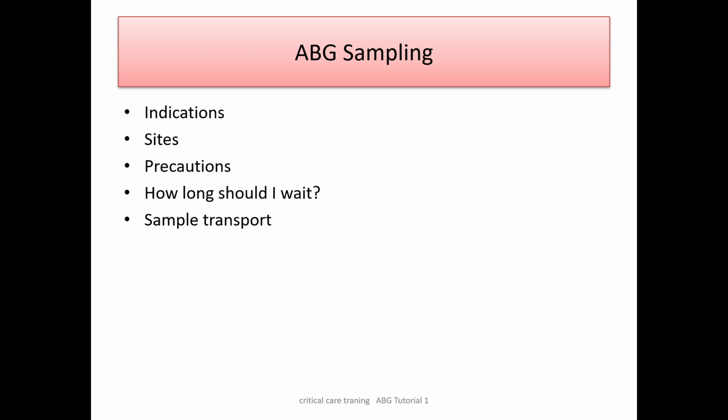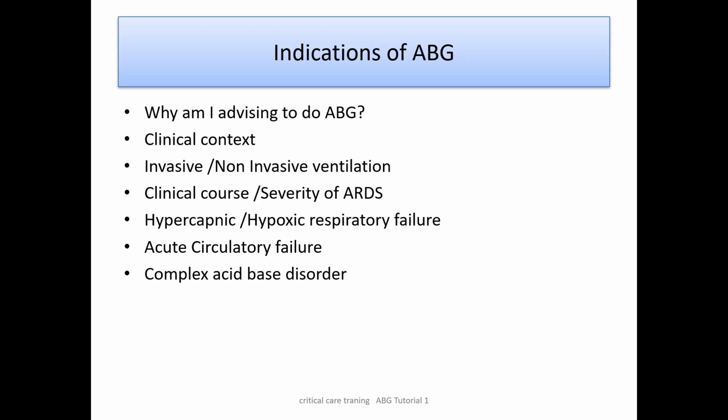When should you send an ABG? If you have taken a patient on a ventilator, should you send immediately, or after 10 minutes, 15 minutes, 20 minutes? And how do you send the sample? Whether you send to the lab or you have a point of care machine, and how sample transport causes erroneous readings, that we should know.